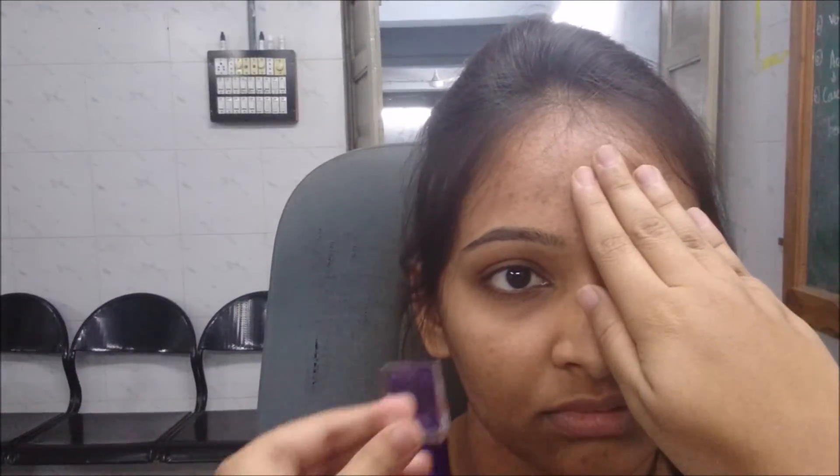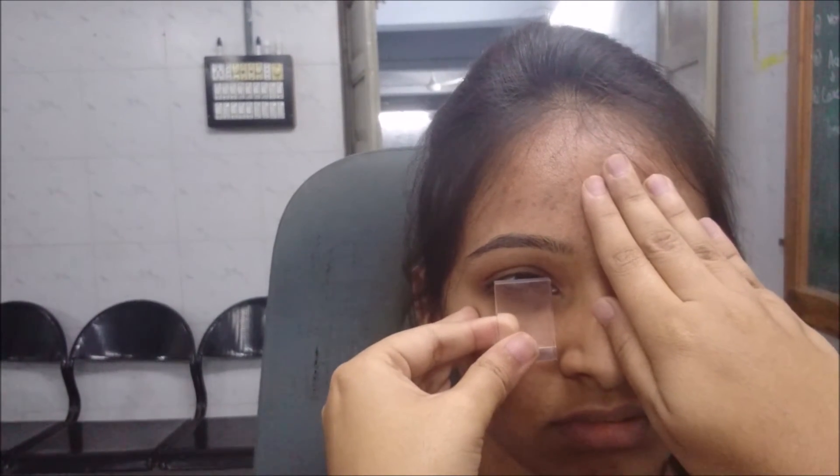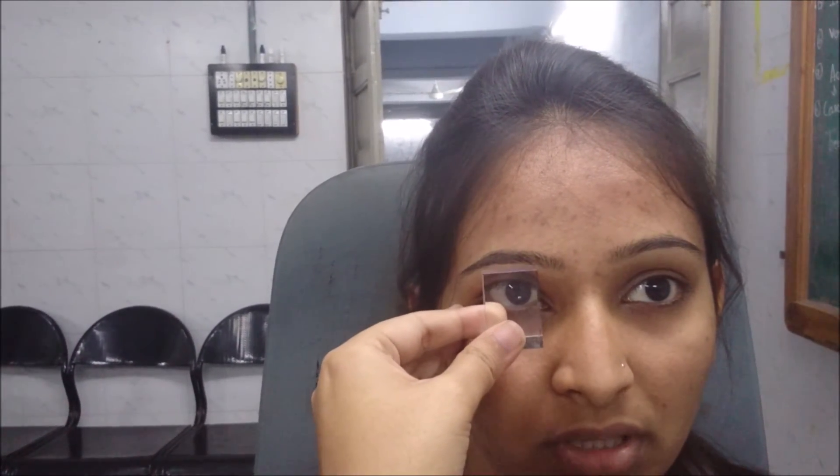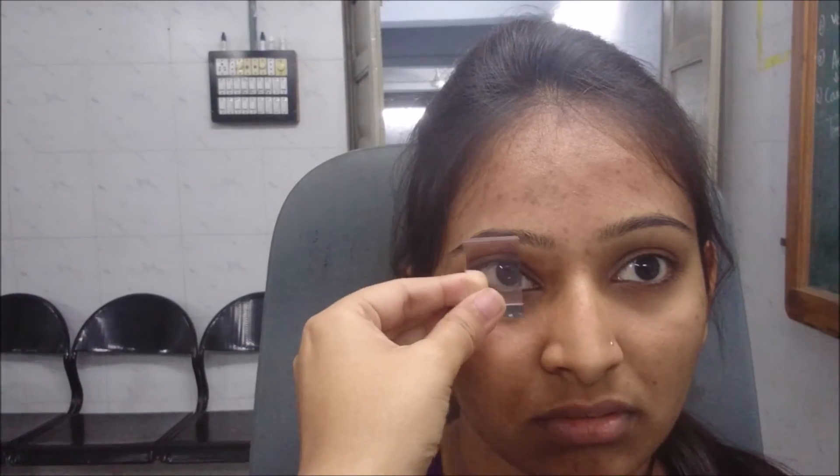The malingering eye is then occluded and a prism is placed so that it covers half of the pupil. The patient reports seeing two images — unocular diplopia. After uncovering the malingering eye, the patient is again asked how many images they can see, and again reports two images. This confirms malingering.